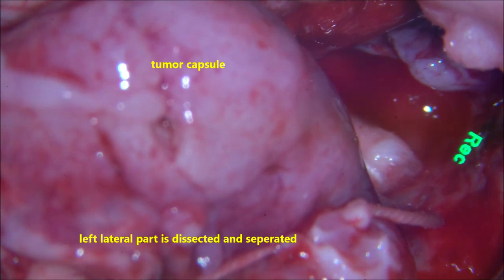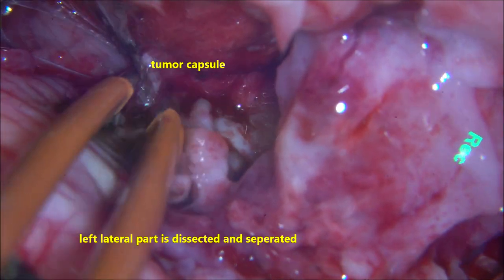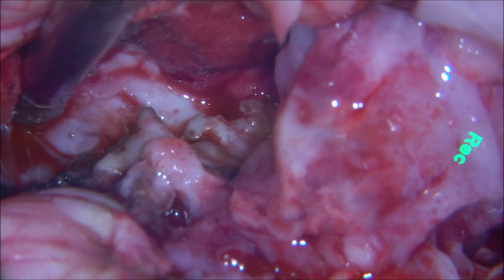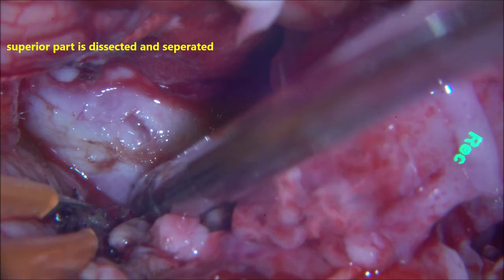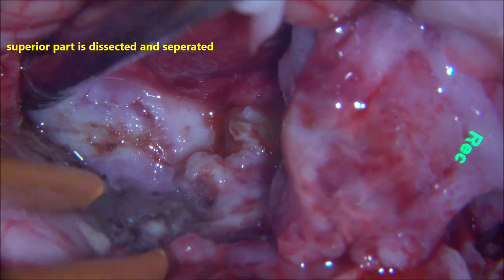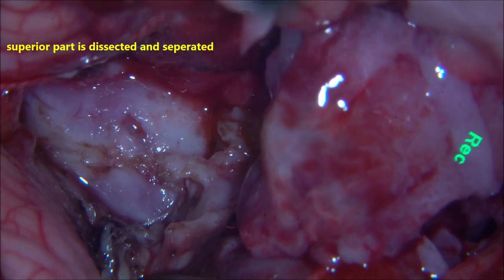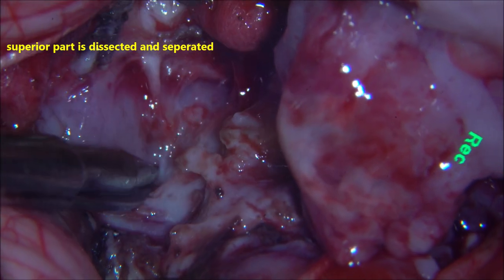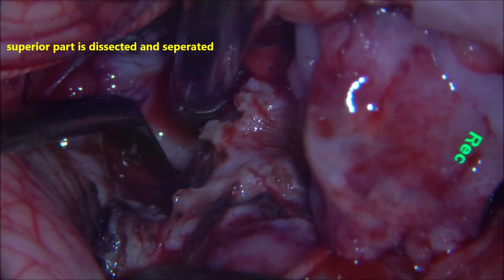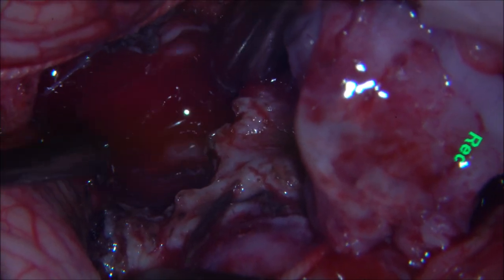Once the whole bulk of the tumour is separated, we can gently put a tag and pull it out. There is more vascularity on the superior part of the tumour, which needs to be coagulated, devascularised, and cut with sharp dissection. That is the superior part of the tumour going anteriorly into the superior vermis. The plane of cleavage is maintained and the tumour is gently elevated, separating it from the normal surrounding cerebellum with a gentle dissector.